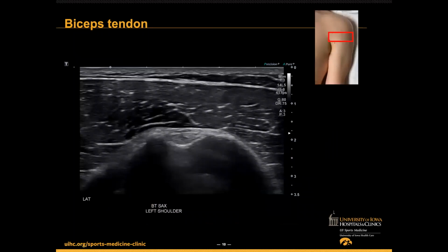So we start scanning. For me, as for most people, home base for the scan anteriorly is the biceps tendon in short axis with the transducer in an anatomic transverse plane. The patient, like I said, at the beginning of the exam is supine with palm up and their forearm supinated, so you can really bring that biceps more anterior and into view. For bigger people, sometimes you have to toe in a little bit because supination can be a little bit harder.